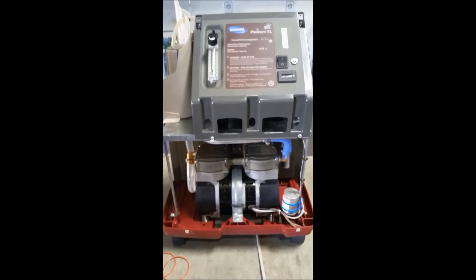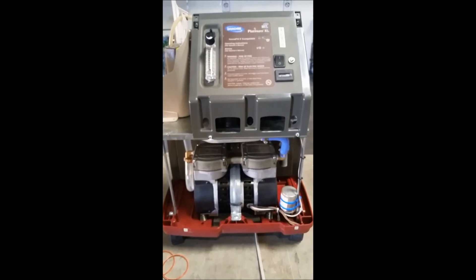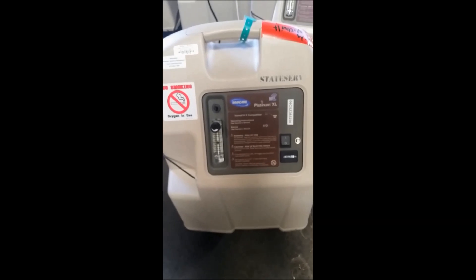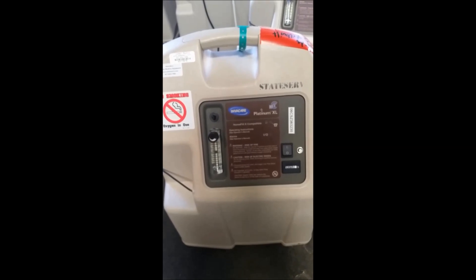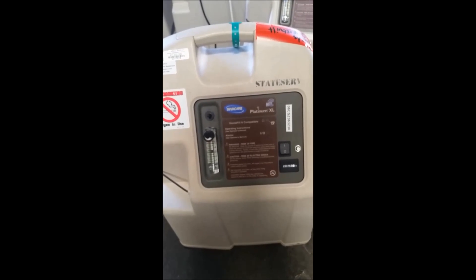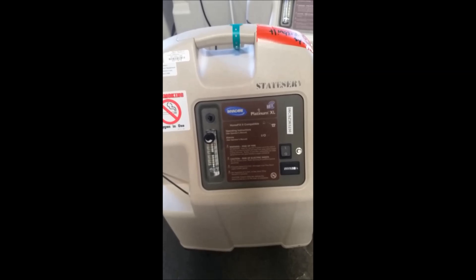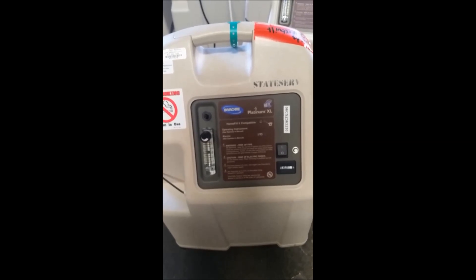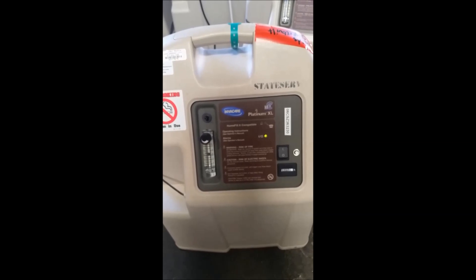We're going to replace the shell and then test the concentrator to make sure that it sounds appropriate. We're listening for the sounds of the switching to make sure that our four-way valve is working appropriately. We're not hearing the loud rattling noises we heard before. This concentrator is now ready to be returned to service.